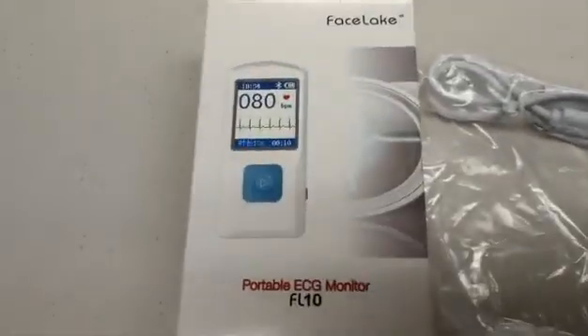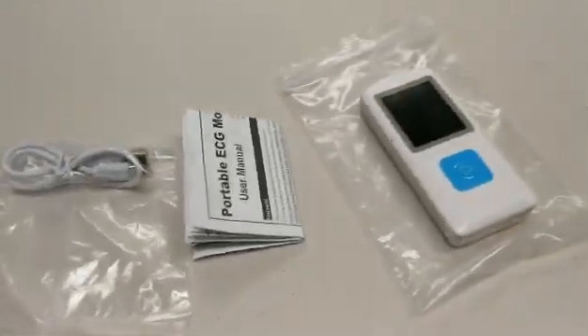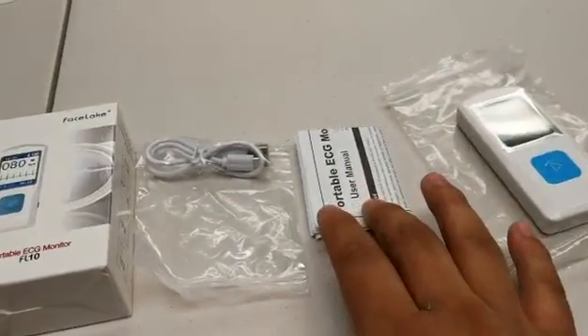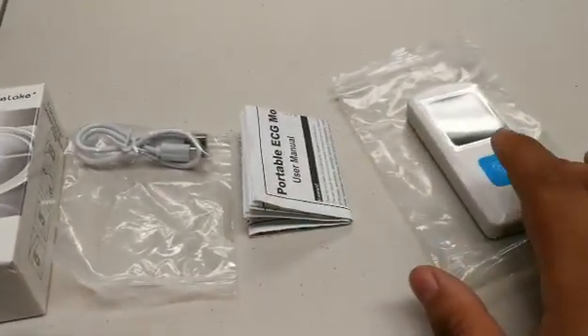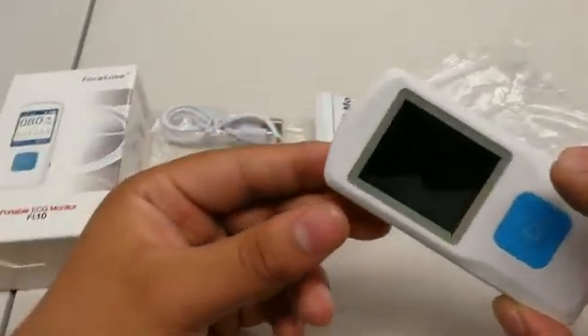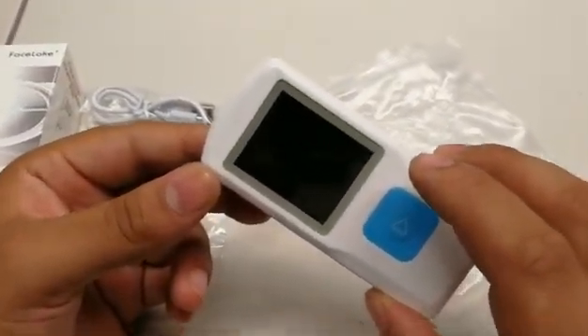Today we will be going over the FL10 portable ECG monitor. Included with this purchase will be a charging cable, user manual, as well as the unit itself. A good thing about this unit is due to its lack of ECG cables, it's great for on-the-go readings.